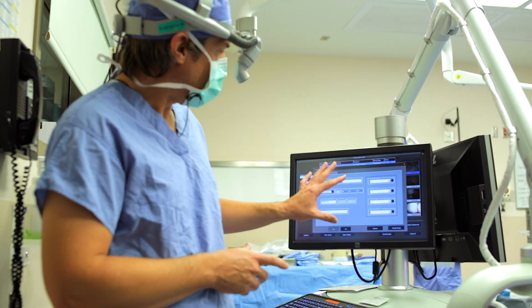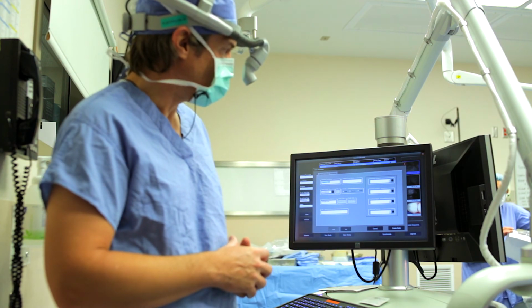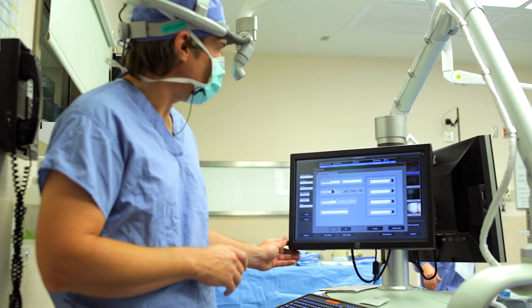New study is going to have a bunch of information that needs to be populated, which includes the patient's name, clinic number, birth date, that sort of thing. And because I'm not the keenest typer, I'm going to have Belinda fill in that information for us.